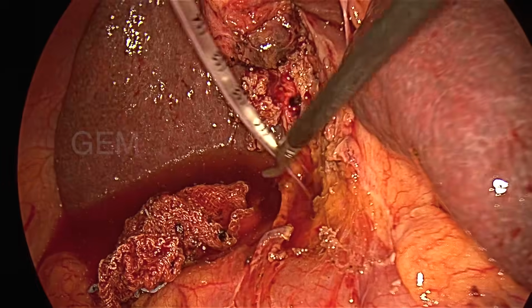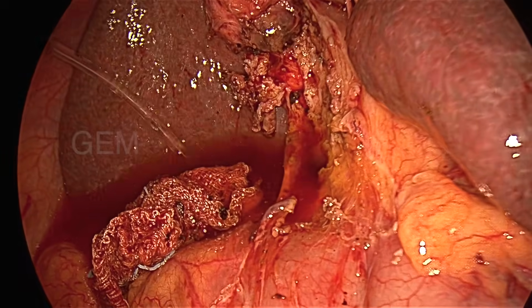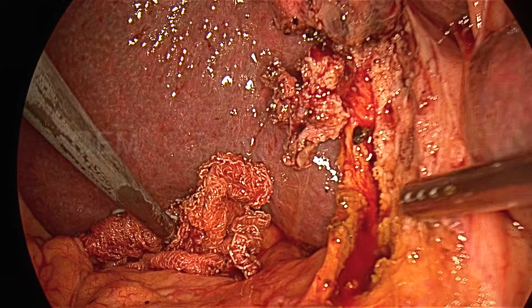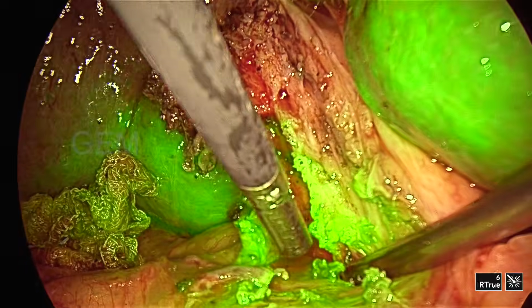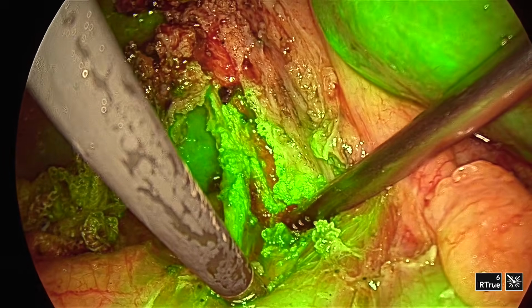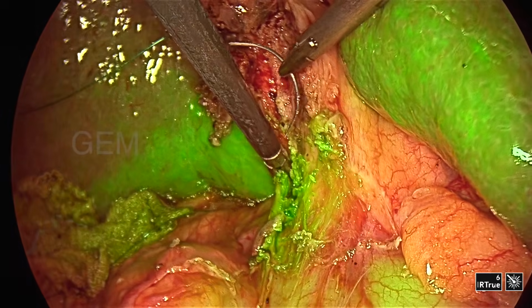So almost I am at the cystic duct CBD junction. All this tube enters easily into the CBD. Actually, I am giving a wash to the lower CBD basically. So now I have to close this cystic duct CBD junction opening. So now again IR mode.